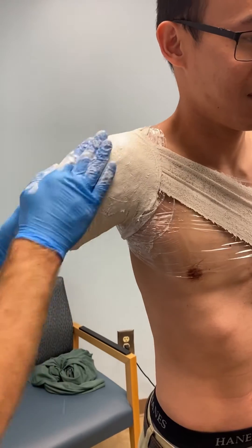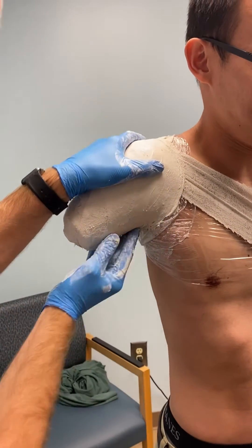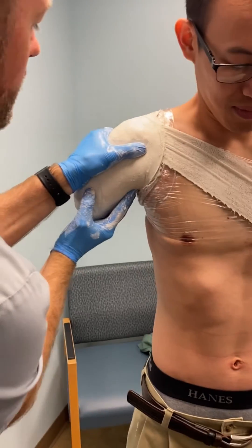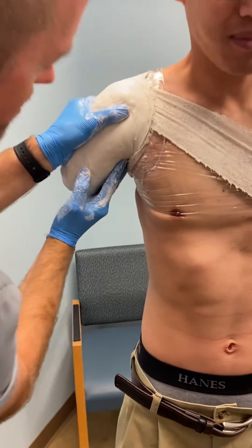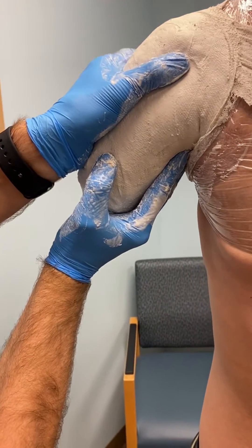Now I'm going to massage all this in. I'm going to squeeze to hold around his shoulder, pushing up, and that armpit will provide a relief with his tendon.